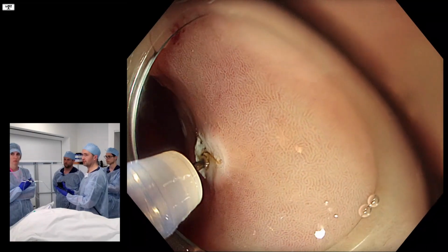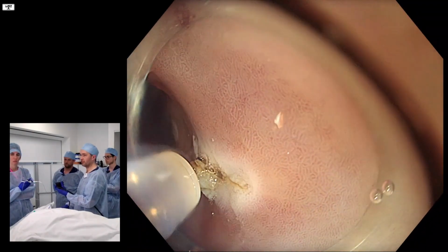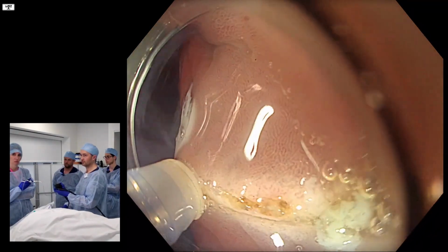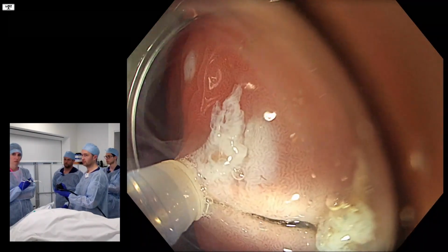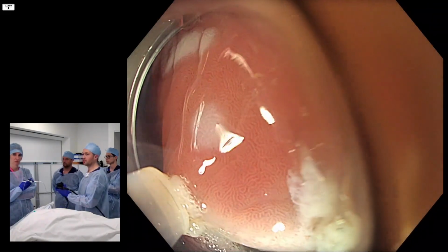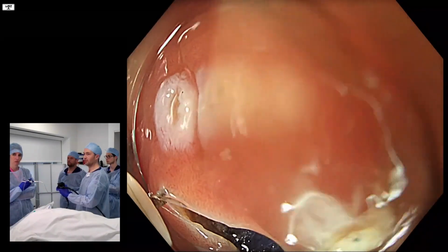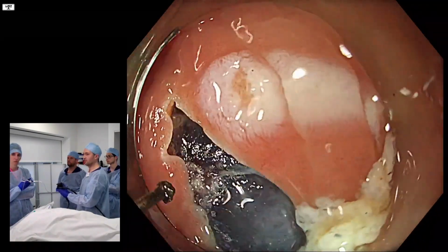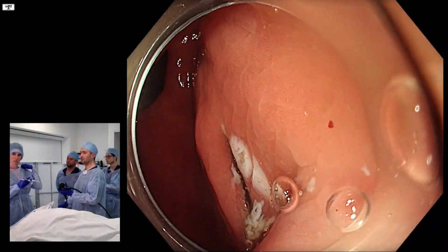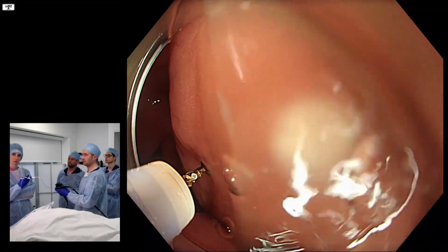Of course, I'm now in the space, I think. Because it's the triangle, it's the triangle knife. Also because I'm in the tunnel space I made, right? So I don't really have to do anything, just have to keep the knife in the plane to do the incision. See what I mean? I mean, it's already coming off, right? So this is much easier than a standard incision would be.